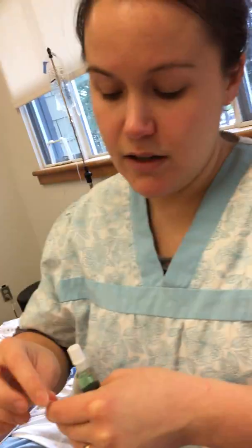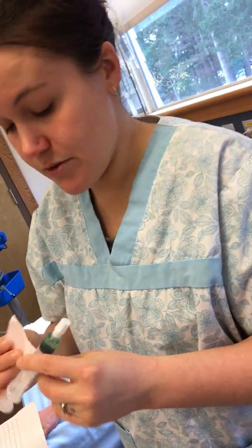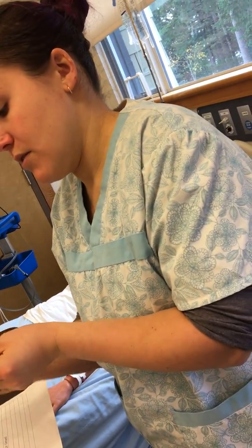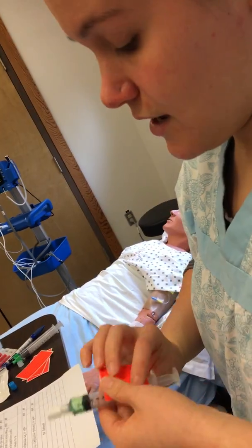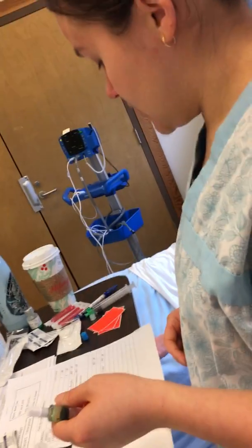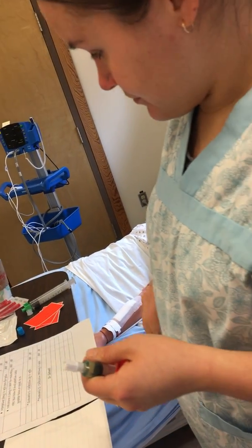And now that I have my appropriate dose drawn up, I'm going to do my third check. Seven rights, blah, blah, blah. Now that I have my medication ready, I'm going to assess what else I need to bring in the room with me. Well, I'm gonna need a pen.